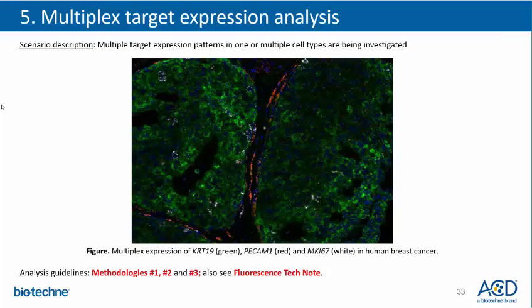Lastly, we have the multiplex target expression analysis. In this scenario, multiple target expression patterns in one or multiple cell types are investigated. There is a tech note available online that provides very detailed guidelines for how to approach multiplex fluorescence data analysis. What is shown here are a couple of examples from different research areas.